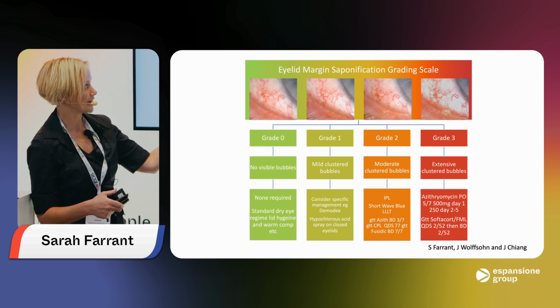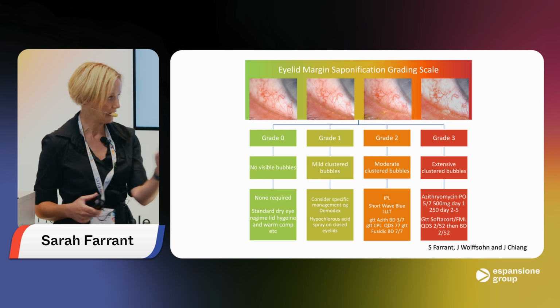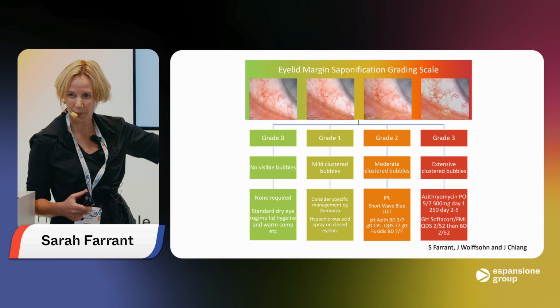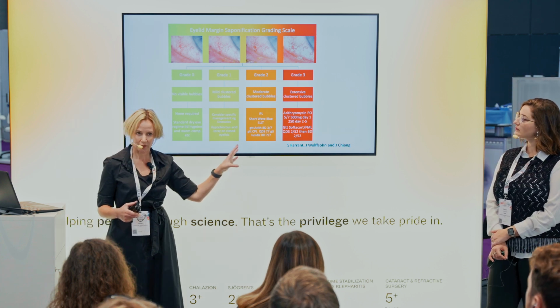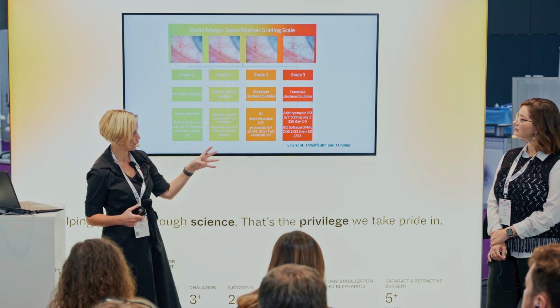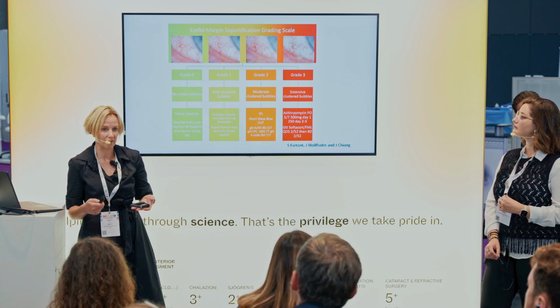But the minute we start to see that we've got an ocular microbiome dysbiosis, we're starting to consider how we can tackle that specific issue. So when it's mild, things like specific management of Demodex, hypochlorous, just simple strategies that are starting to target the issues with that microbiome. When it gets a bit more moderate, we start to get a little bit more aggressive with the options that we have. So considering IPL, considering shortwave blue low-level light, which we'll talk about in a moment. And then obviously all the other options that we have on prescription. So watch this space for how this will develop over time, but we will start to publish some data once we've developed it on the scale.